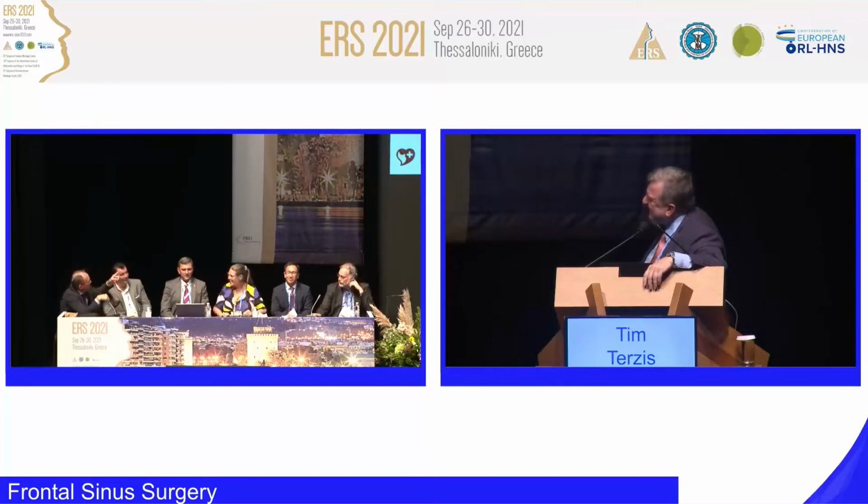And Tim, talking about surgery here, it's not easy. It's very high up, and the diameter, even when you do a type 3 or you take the internal beak, it's hard. You get it away from the pedicle, but then you cannot grab it because the diameter is too deep. It's not easy.